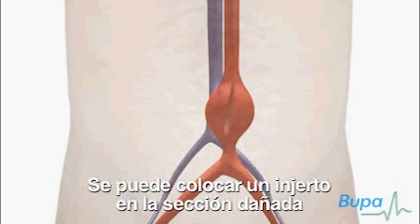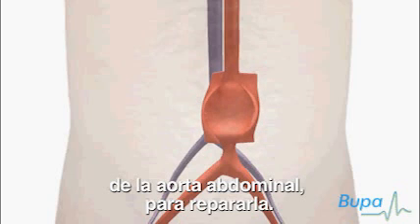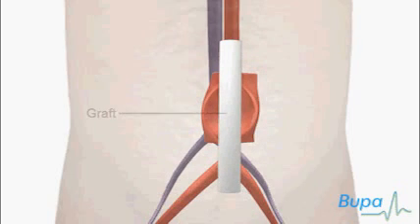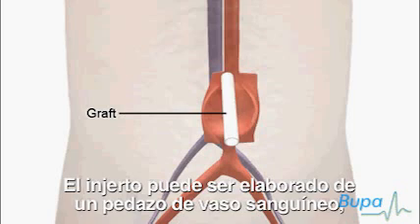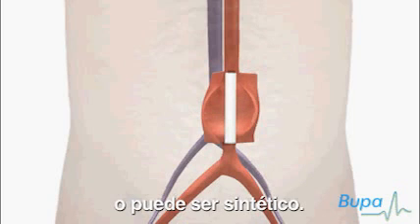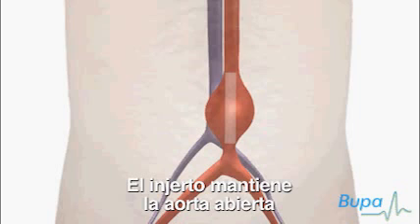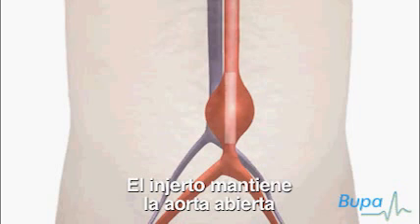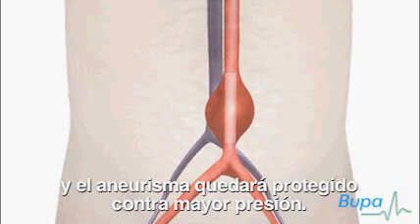A graft may be placed in the damaged section of the abdominal aorta to repair it. The graft can be made with a piece of blood vessel taken from another place in the body, or can be synthetic. The graft keeps the aorta open and the aneurysm will be protected from further pressure.